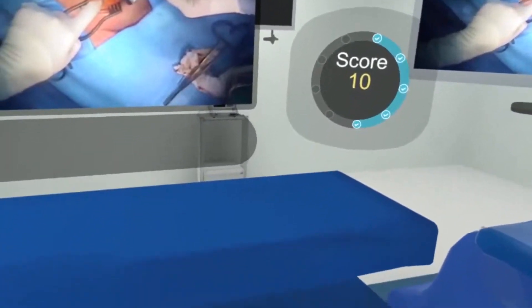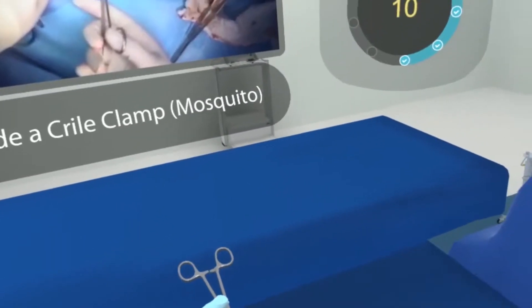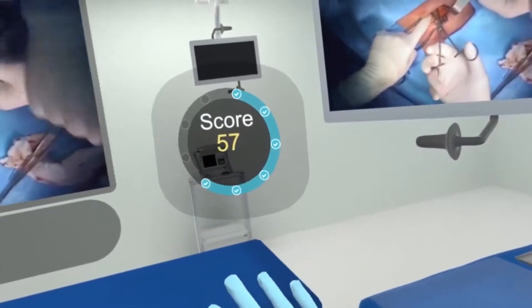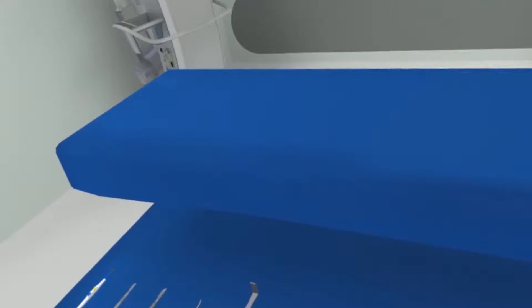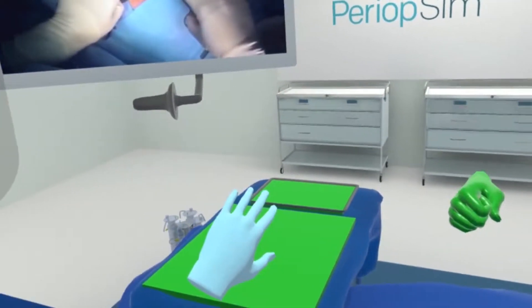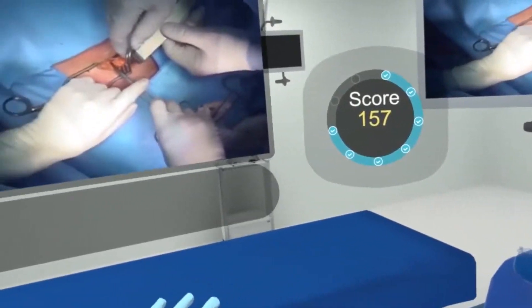Crile clamp. Not to the neutral zone — it was yellow, and you can see my score decrease significantly because of that. I know that he wants two of them. One more Crile clamp — correct. So my score's back up.